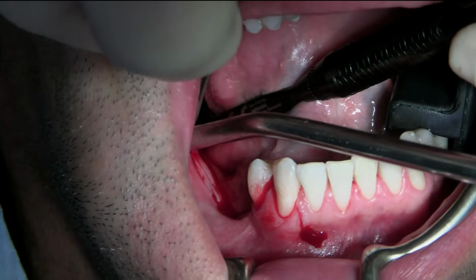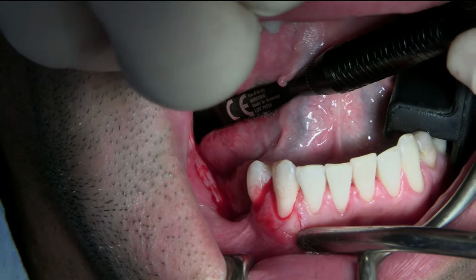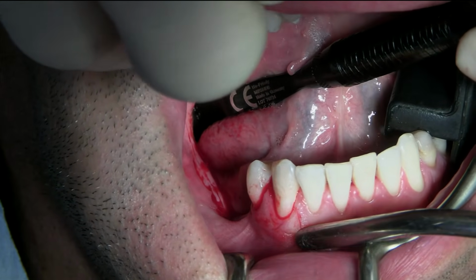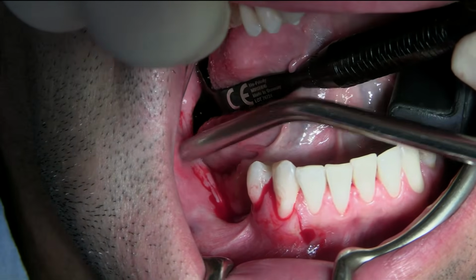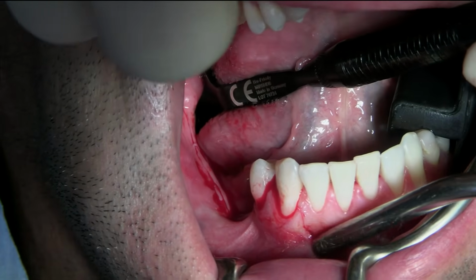Now on the distal, I'm going to extend a little bit more posterior because we're going to have to harvest some of our autologous bone. Now I'm going to move my direction buccal, always staying in touch with bone.